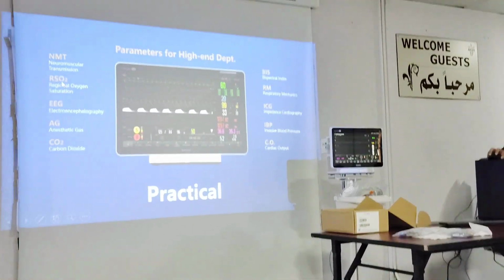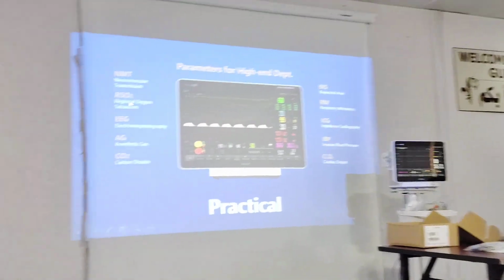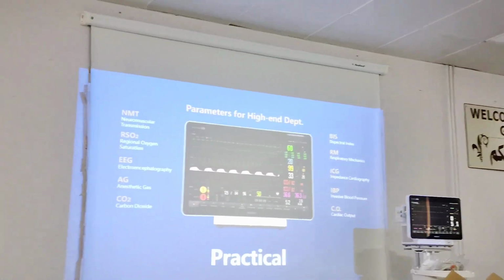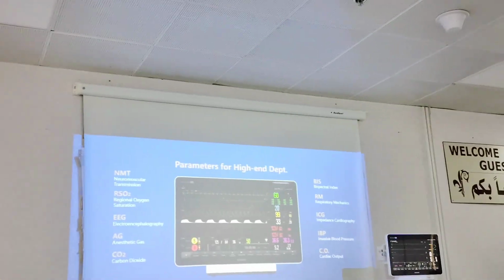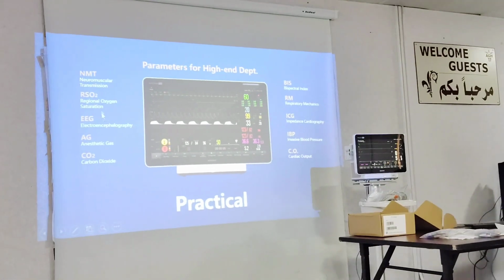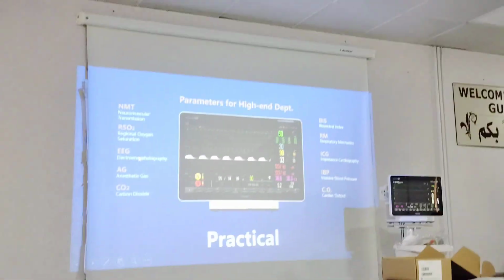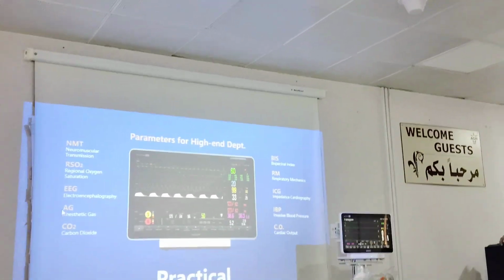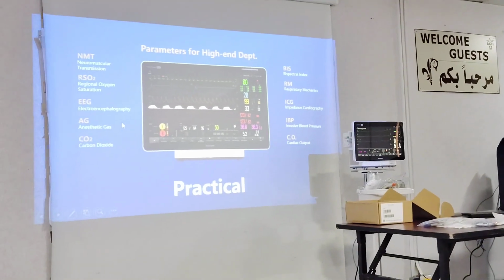Nobody knows, okay. Regional oxygen saturation. Anybody know what that is? Regional oxygen. Yes? SpO2? No, it's not SpO2, but good guess. It's similar to SpO2 but different. Okay. Next, EEG. Yes, electroencephalography. You guys know what this is, right? Yes, we use it as an option for that one. Yes. All of these are available in the P series.